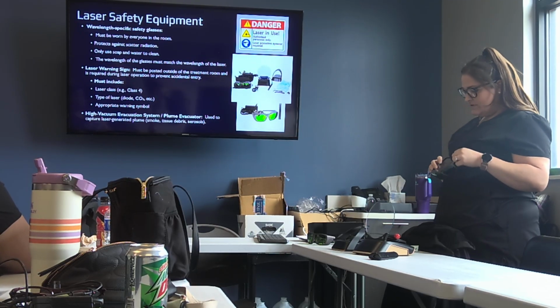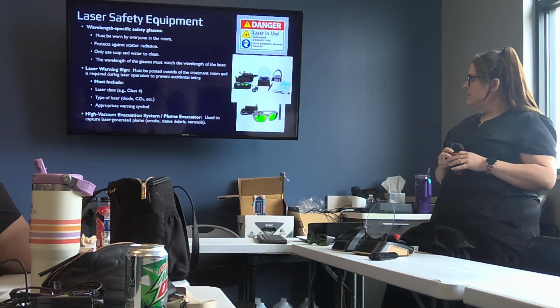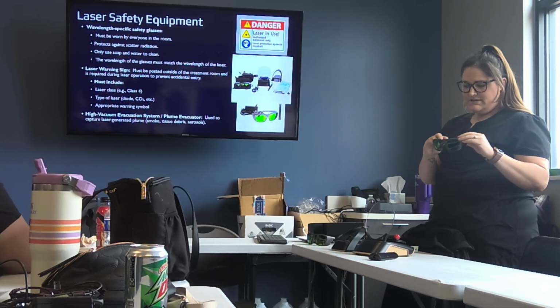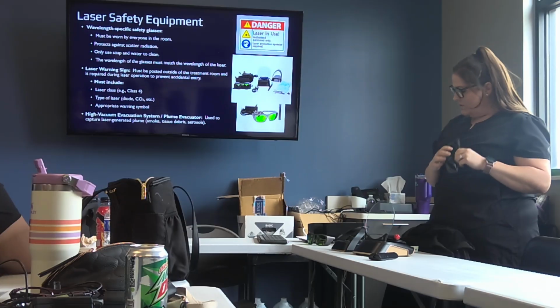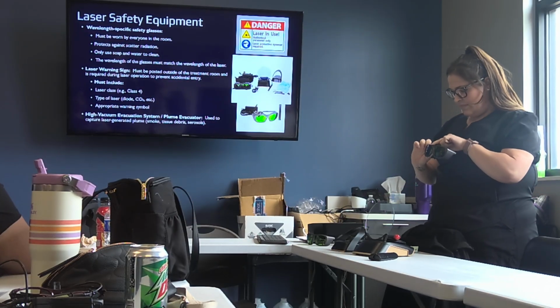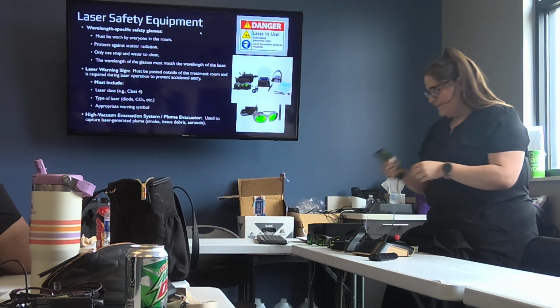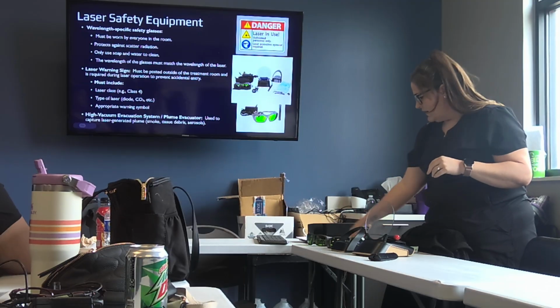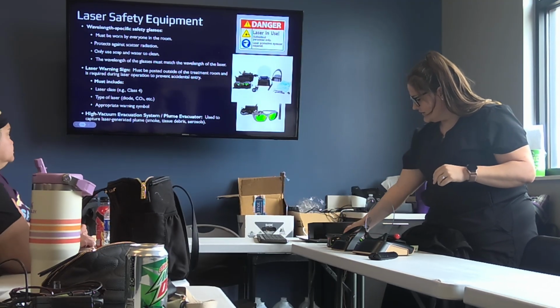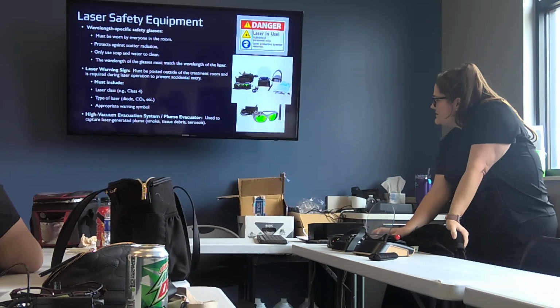So for some of those lasers, when you're using them for cutting bone and hard tissue, you might have to change out the glasses. I was looking at these. They are noted, like at the top, what nanometer it is. So this one, I think, is for hygiene, yeah. So just make sure that everybody checks that so that you're not wearing the wrong glasses.